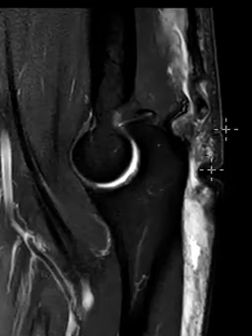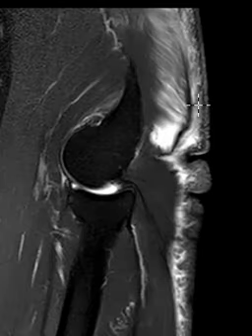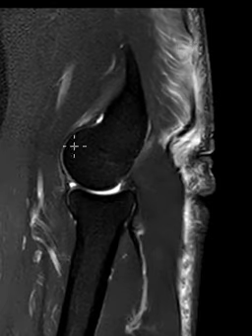Now this patient also had a tear here of the lateral. This is the lateral head. It's part of the muscle. You can see the central tendon coming down, and then it ends there, and it starts back up here. So this patient has a high-grade tear here of the lateral head, including the torn, separated central tendon.